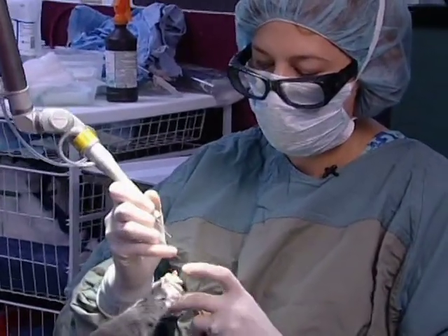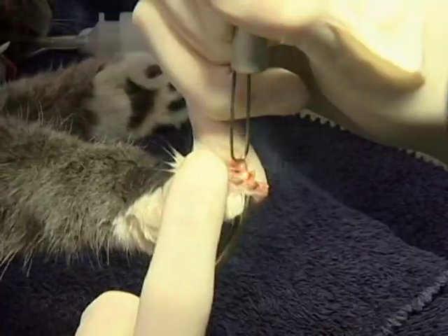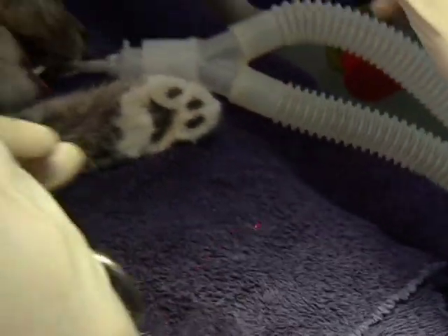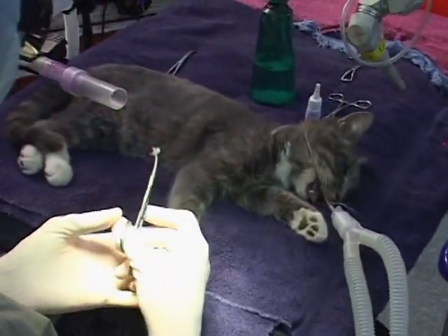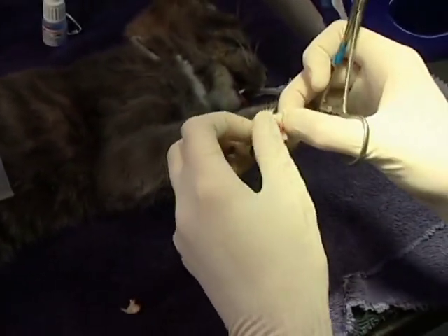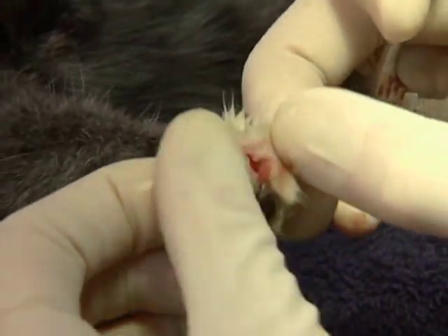The last step is removing the tissue that's hanging onto P2. I'm walking it off. Now I'm seeing the tissue move, and I know I'm right up against P3. So I've removed the claw. The black on that nail — that's P3 — I'm going to remove it. I'd rather hit this than P2. So that's removal: no bleeding, no swelling. That's it.